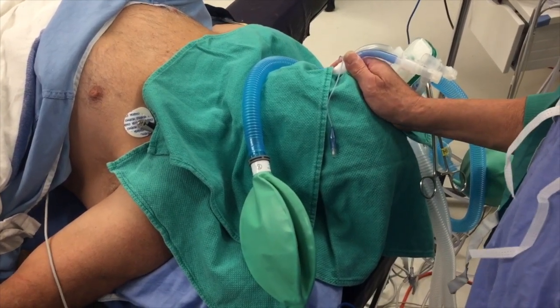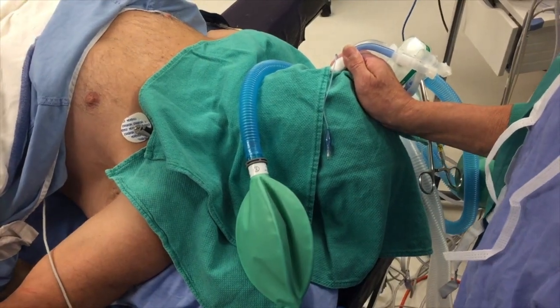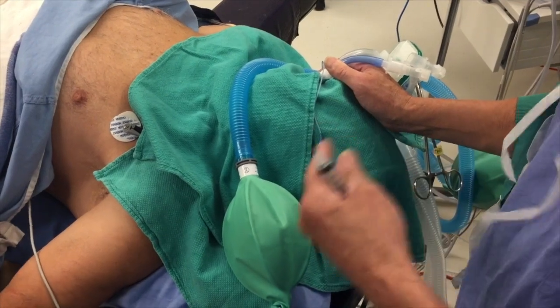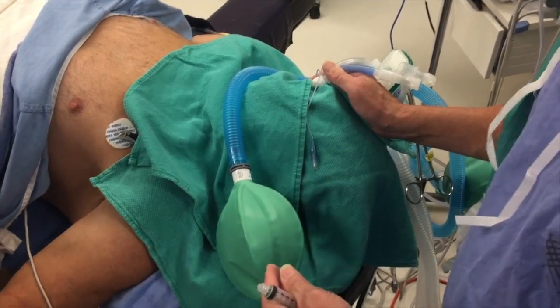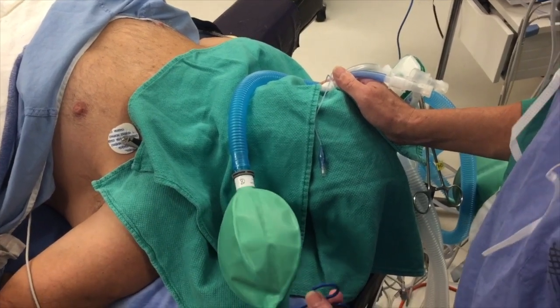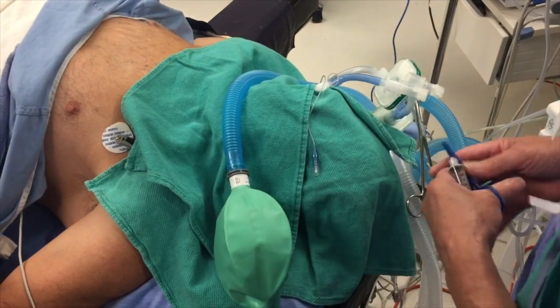Now what I'm going to do is gradually pull back on the tube until I create a leak again. There, we see now we got air accumulation there. We stopped. So now we can see I just created a herniation in the cuff. So this is a very useful monitor when we're positioning the patient to the lateral decubitus.